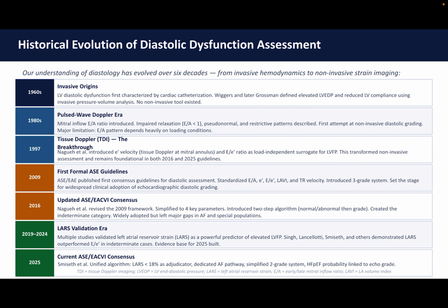2019 to 2024, the LA strain era. Multiple studies showed that LARS less than 18% predicts elevated filling pressure better than the E to E prime alone in indeterminate cases.